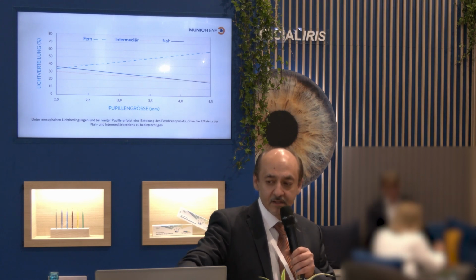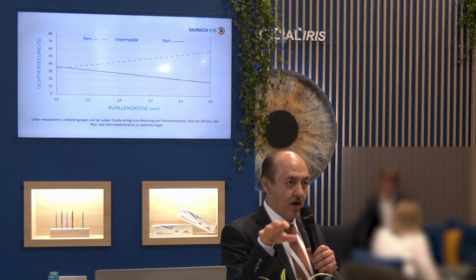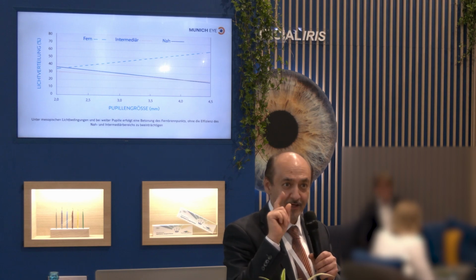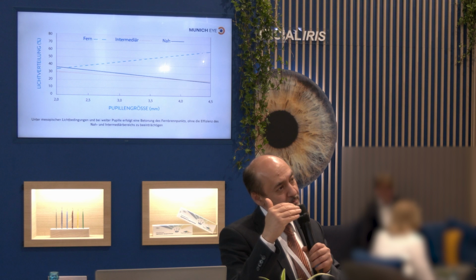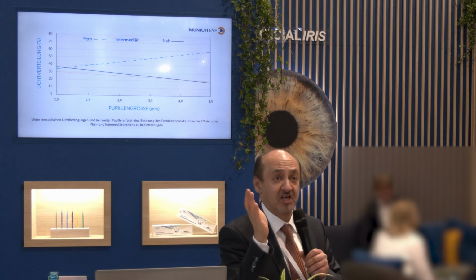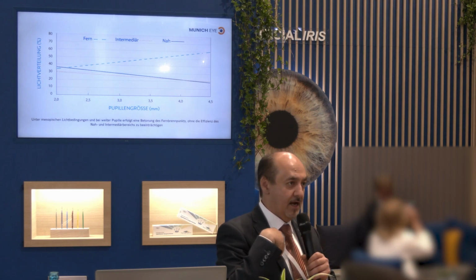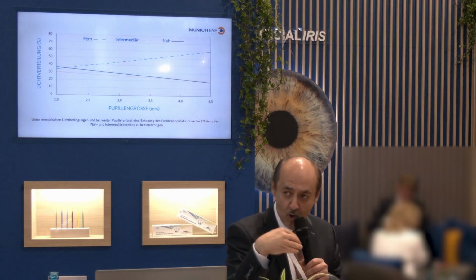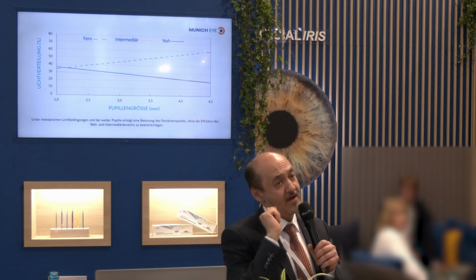As you can see, the light distribution is 30%. Yes, the light distribution of a classic trifocal lens from major manufacturers is also close to 30%. No one is better at that. Accordingly, you have to see and recognize that patients in the near and intermediate sector never really have an issue. If my refractive patients are dissatisfied after clear lens exchange, i.e., even if I have promised closeness and have not kept it, forgive me if I take something away from you, no one will forgive me.